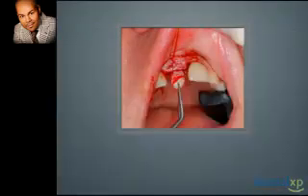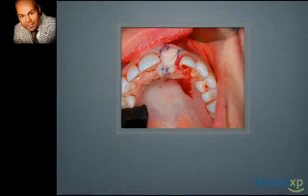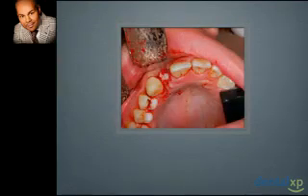And you see just the different grafting techniques using the molding of using the connective tissue graft and placing it underneath the tissue here. Well, as I stated, I researched the work of Dr. Kobe Landsberg and felt that increasing the keratinized tissue or maintaining the keratinized tissue at the gingival margin was very important and helped to prevent shrinkage of the tissue. So just different methods in doing this, different areas.